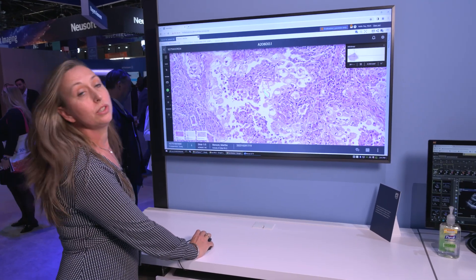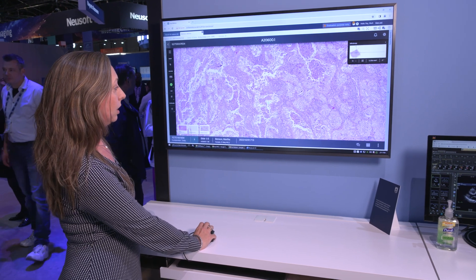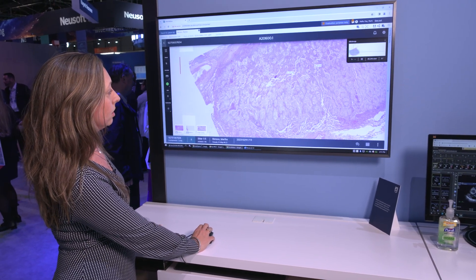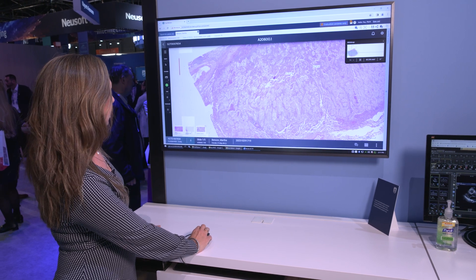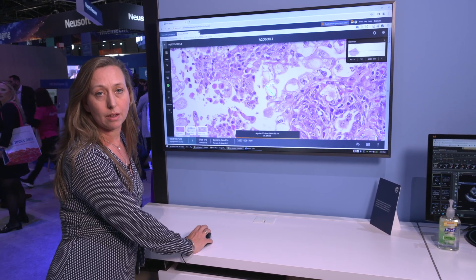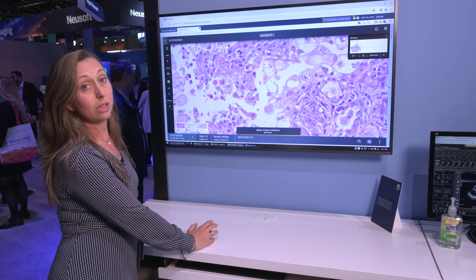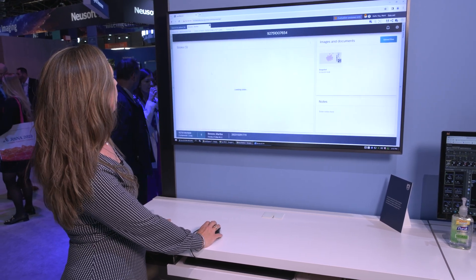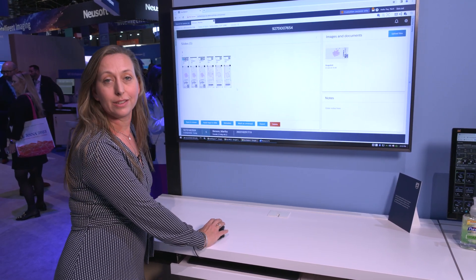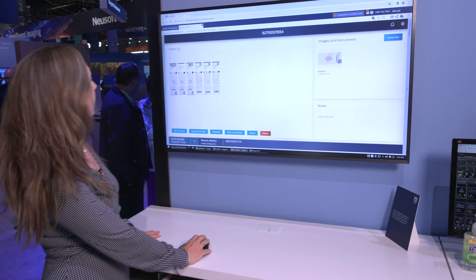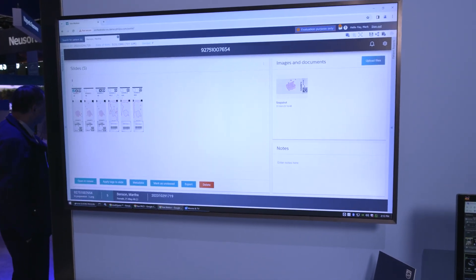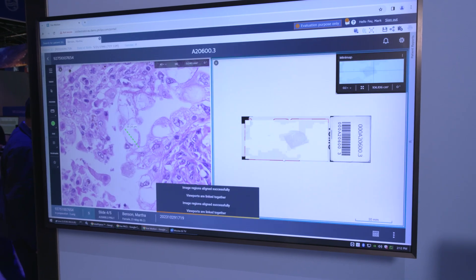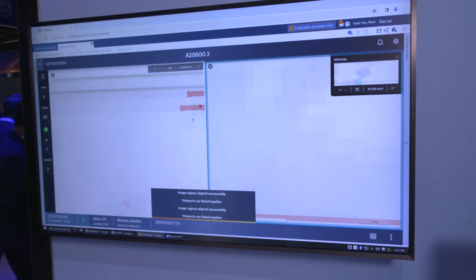This means you can use the viewer to look at the pathology image, zoom in and out, look at previously made annotations or measurements and make new ones. You have access to all the slides in this particular case for this patient and also look at images in a side-by-side view.